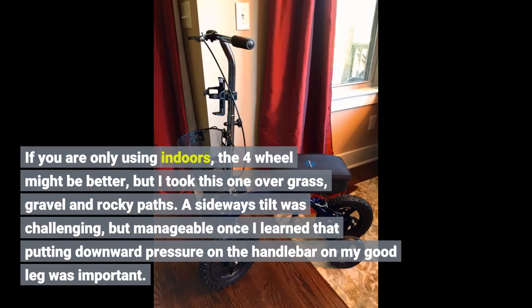I would recommend this product for anyone needing a knee scooter to use off the beaten path. If you are only using it indoors, the four-wheel might be better, but I took this one over grass, gravel, and rocky paths. A sideways tilt was challenging but manageable once I learned that putting downward pressure on the handlebar on my good leg side was important.